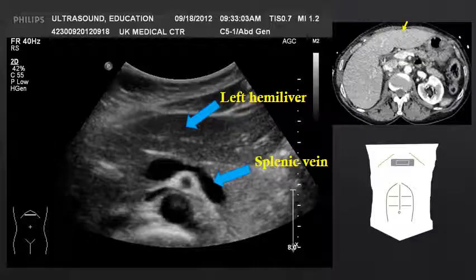Deep to the left hemiliver, we can see the portosplenic venous system, with the splenic vein highlighted with the blue arrow and then the yellow arrow on the CT. We also see the aorta deep to the portosplenic system, which can also be readily identified on CT.